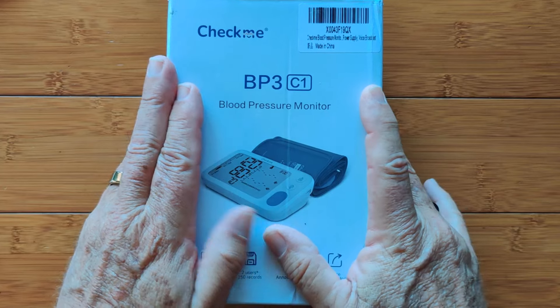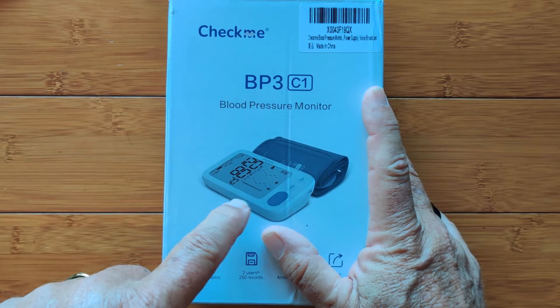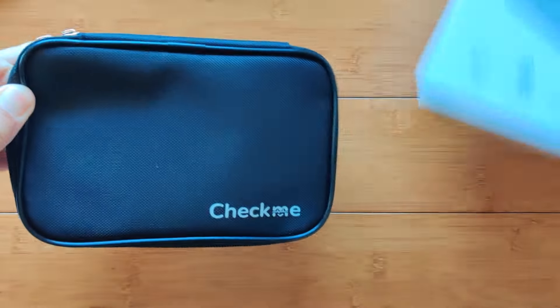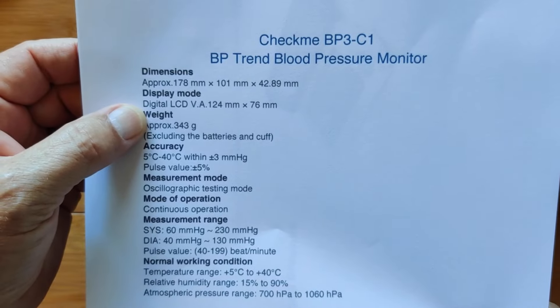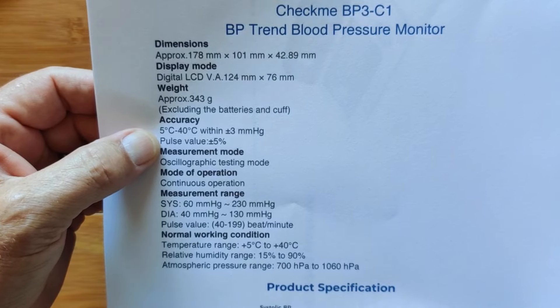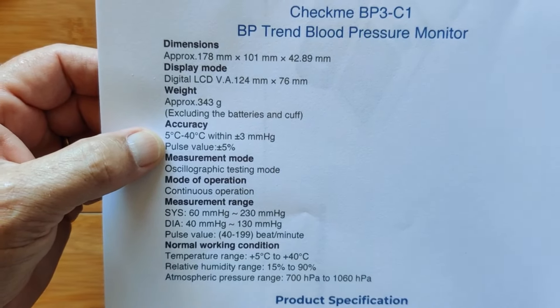For an inexpensive blood pressure reading device, CheckMe just put this one out. It's 60 bucks, dropped to $35 with a $25 discount if you use code TIX at checkout. When you open the container, you get your blood pressure unit all put together — ready to put in your medicine chest or wherever. It has an LCD that's about a 5-inch display, and it also has voice prompts that read results back to you.